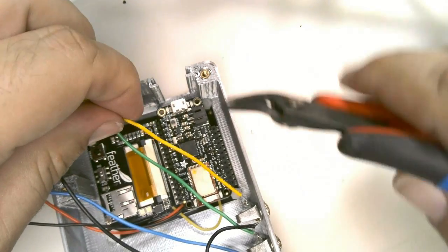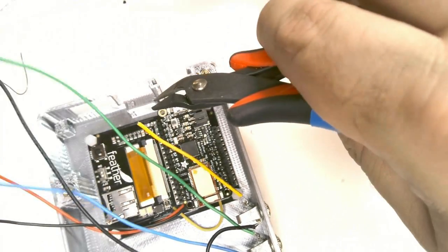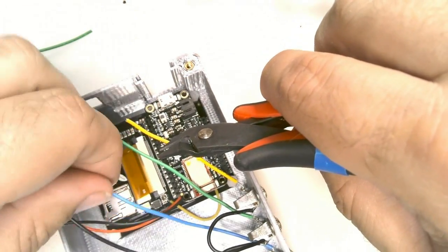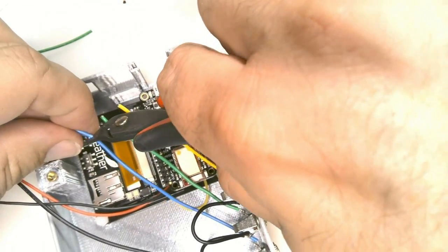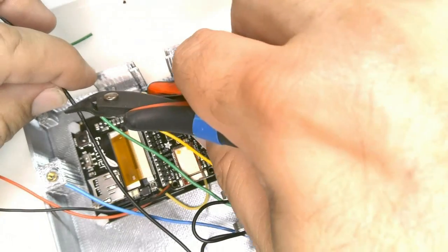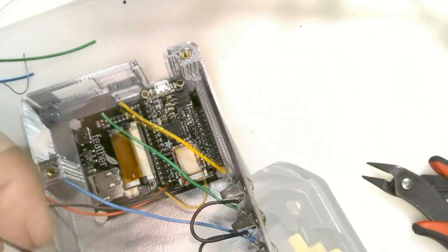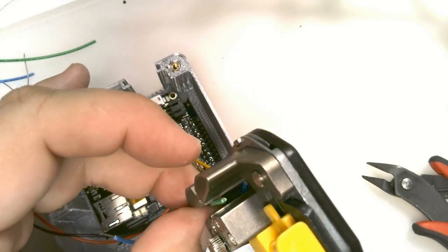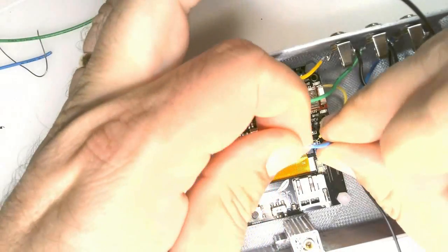Trim each of the wires from the jacks to an appropriate length. They're going to plug into the TFT board in little sockets next to the feather board. Strip the ends of each of the wires so that it can be plugged in.